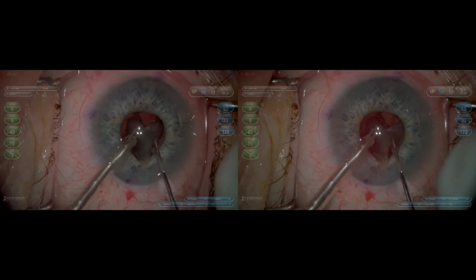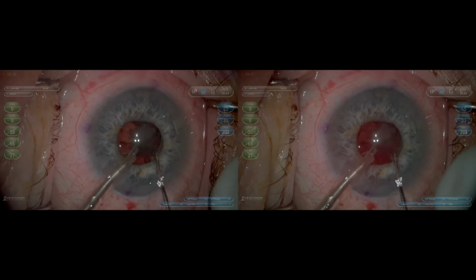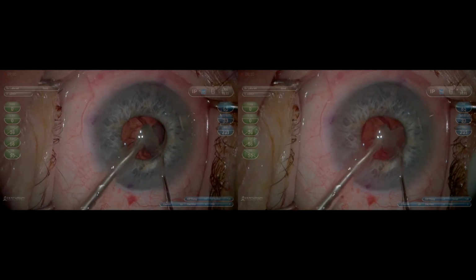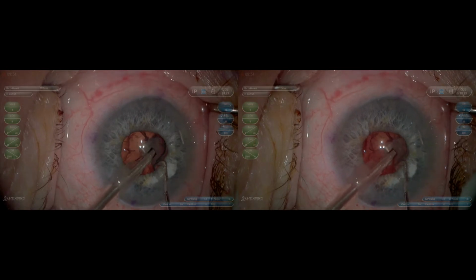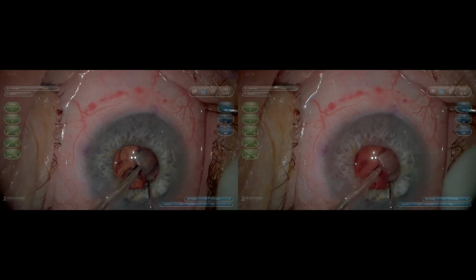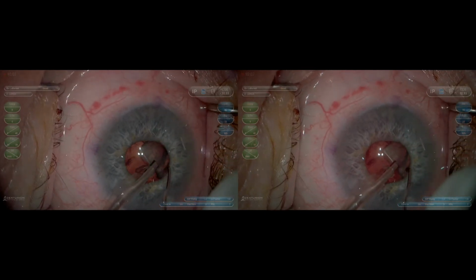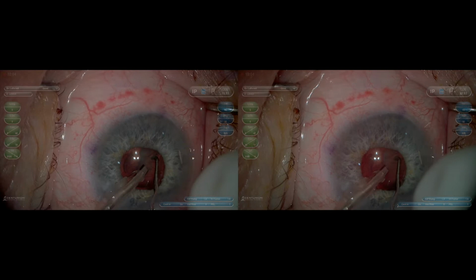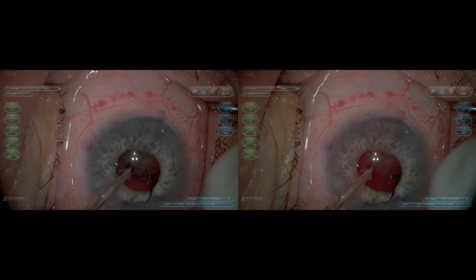It becomes a pupil independent technique because I'm bowling out within the pupil even if it's 5 millimeters or less, and then pulling quadrants in. Having a good visualization allows me to then pull quadrants through the cracked area into the central bowled out area. It's allowed me to avoid using pupil expansion rings in the last 5 years because of this technique.